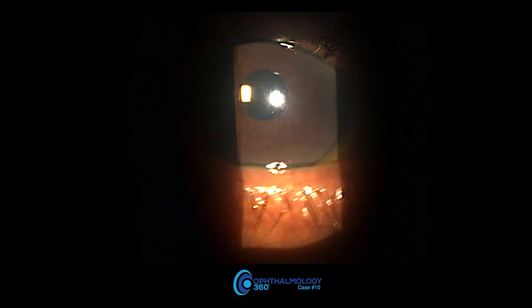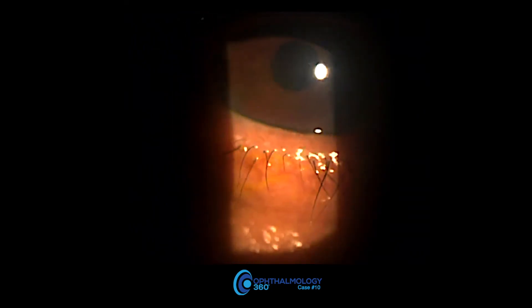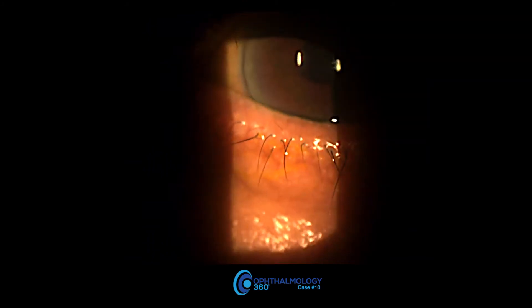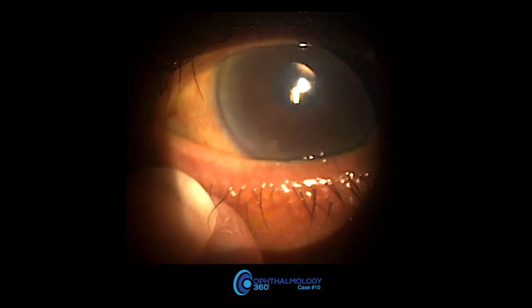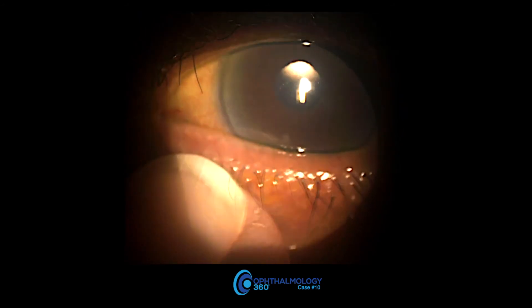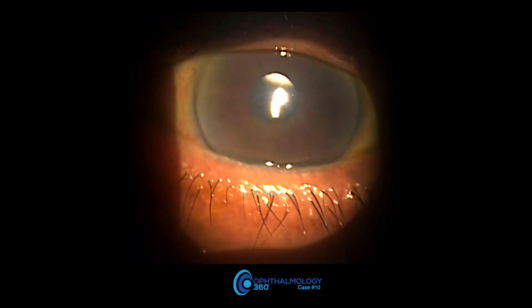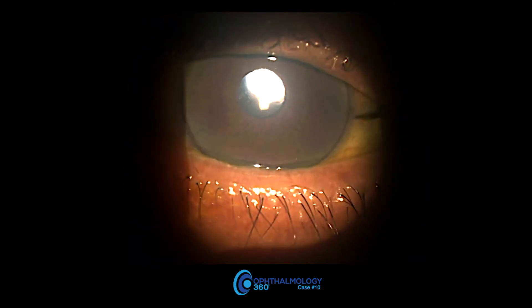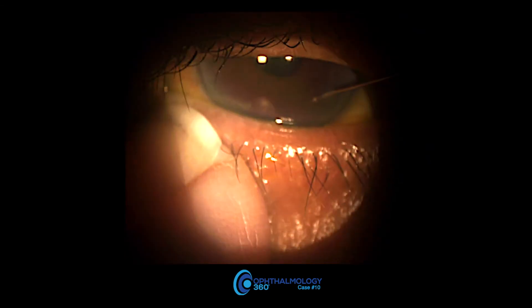Here you see another pseudophakic patient for the Darista. She was a little bit more nervous. I did a little counter pressure on her with my finger and I had a nice acute angle. One thing you learn with this injector is if you have your finger a little bit more posterior on the injector, it will often come out faster and a little bit more smoothly. You can't always predict it, but you can see that this came out very quickly.